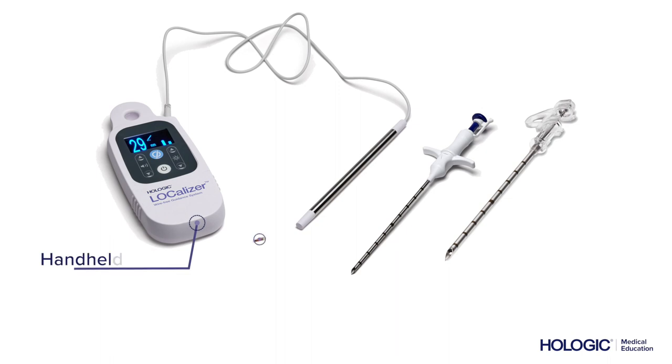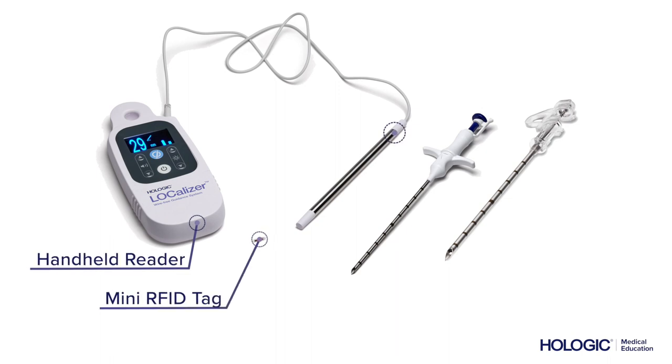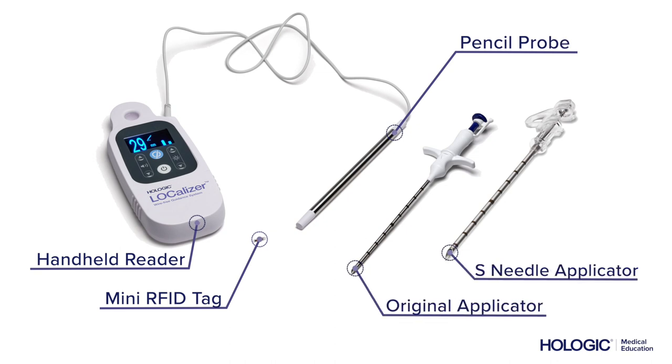The system consists of a handheld reader, a mini RFID tag, a sterile drape, a pencil probe, and two different types of needle applicators.